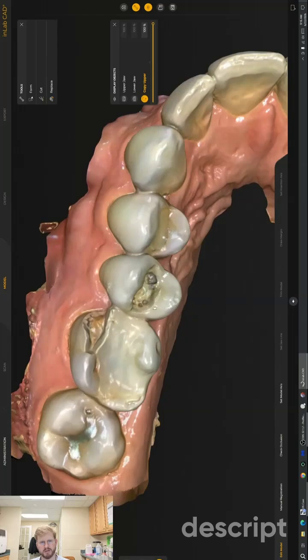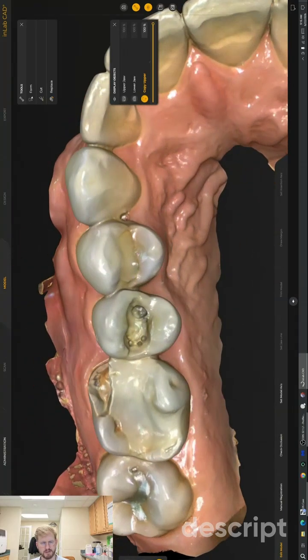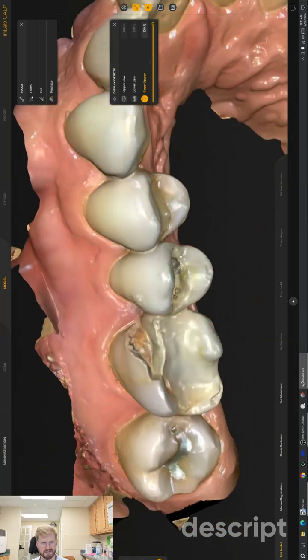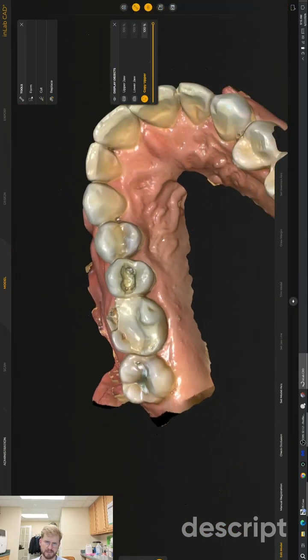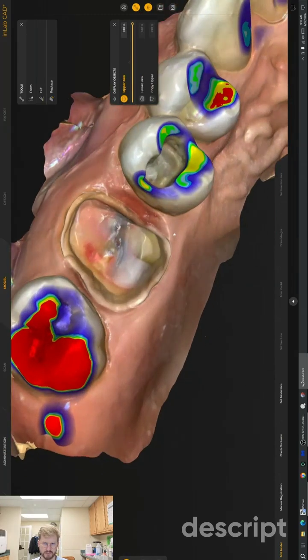Here she blows. So number 3, fractured mesiobuccal cusp. Had a little recurrent decay under there. Probably the reason it broke is just got a little cavity, and then that tooth structure was weak. And we prepped it for a crown. There's our crown prep.